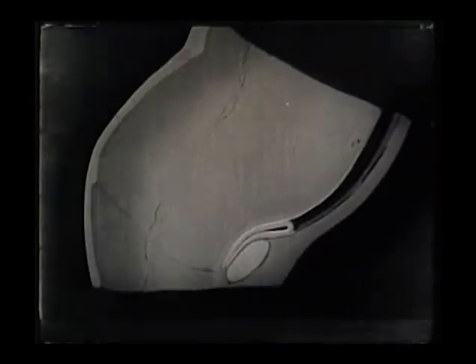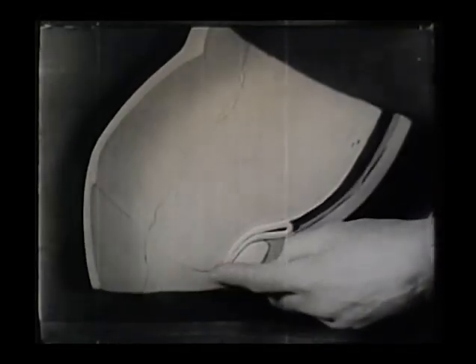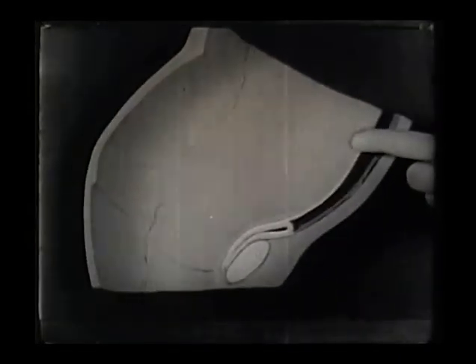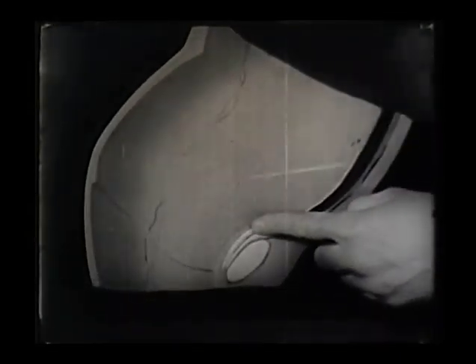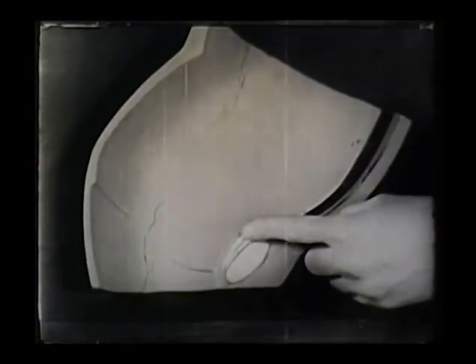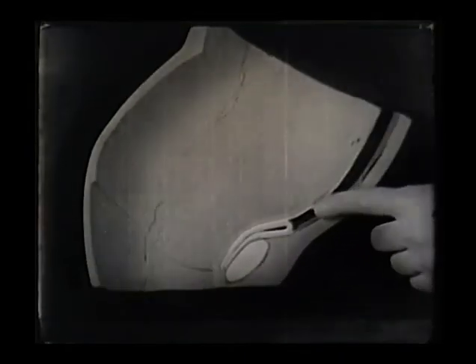Here is a model of a woman who has been in the second stage for a long time. And you can see how long and thin the lower uterine segment and cervix are. They are fully 15 centimeters long, and the lower uterine segment almost invites you to cut into it. When you do your first low cervical, select the case where the labor has been on for a considerable length of time, and that makes it much easier. You see how thin it is. Here is the peritoneum again, and here is the contraction ring.